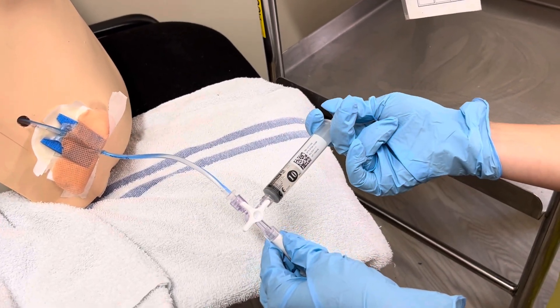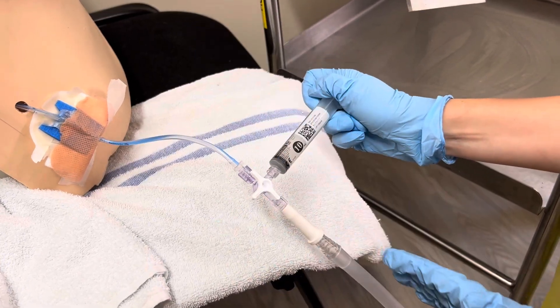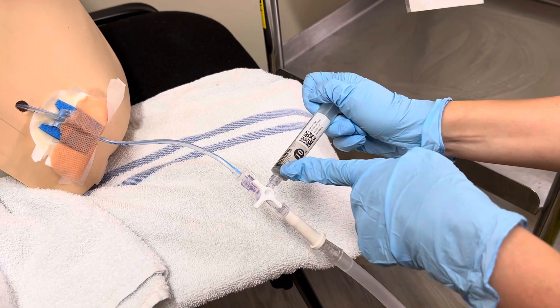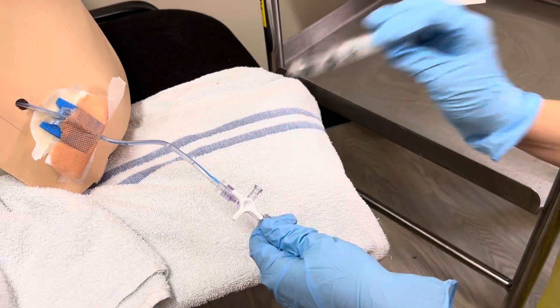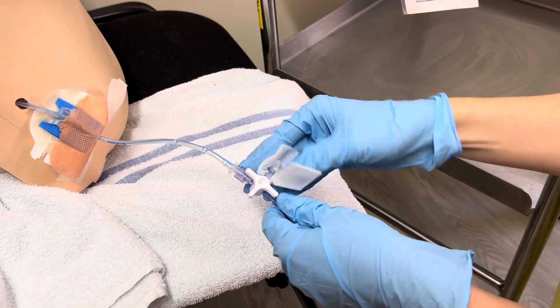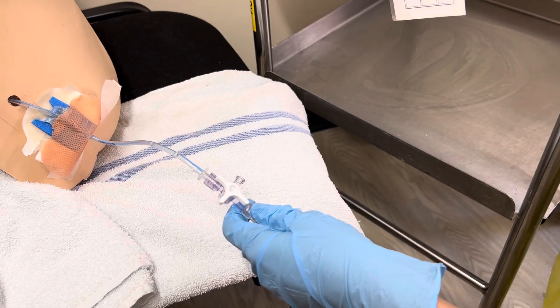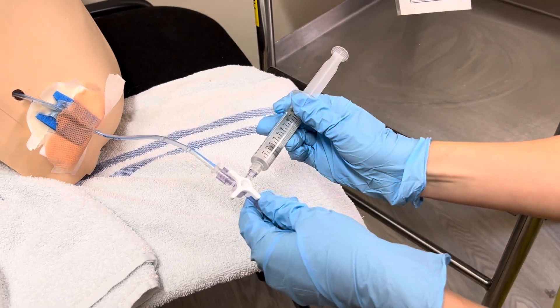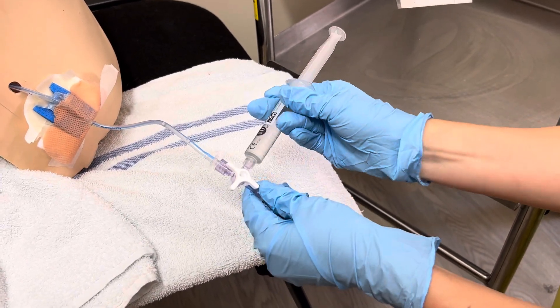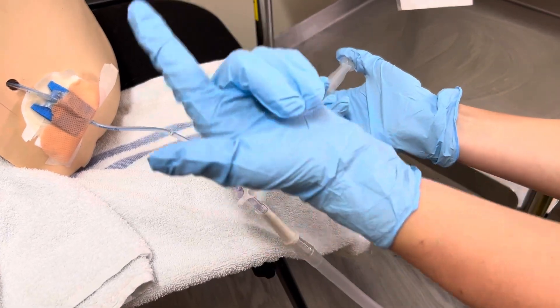That should help clear any blockages in the drain. Turn it off by putting the arrows back up and down but off to the bung. Remove the syringe, perform another 30-second clean, then reattach the new flush, turning so you're again off to the bottle and open up to the drain.